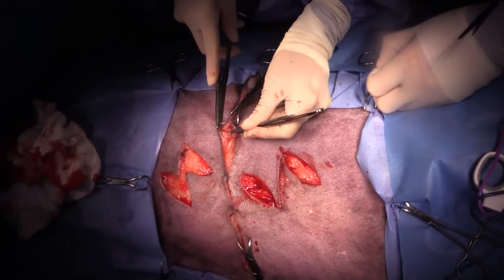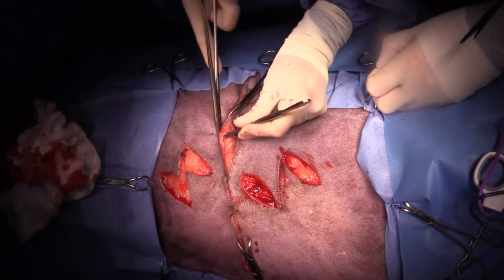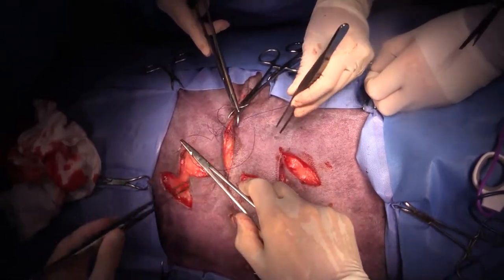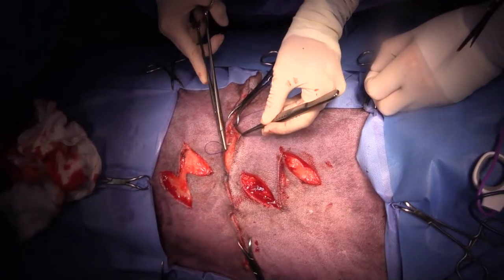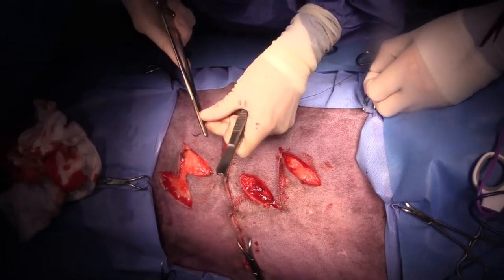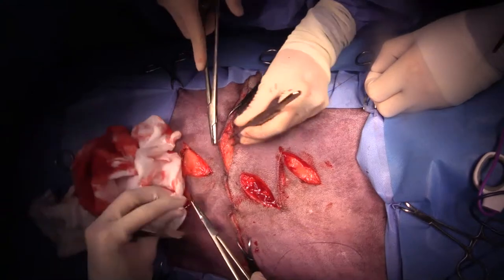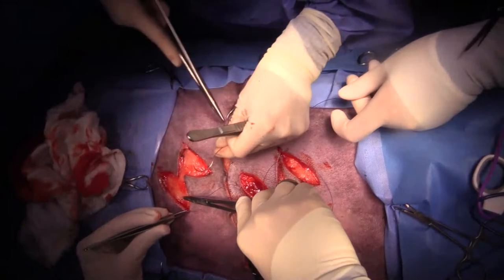All right, we'll get Jeff over here to help with the closure. So just put a little buried intradermal suture at each point, point to point. And then we're just going to do inverted, almost like a mattress cruciate suture. That's what Sarah is doing there. And we'll see how it looks when we're finished with that.